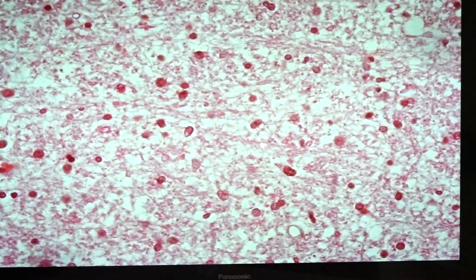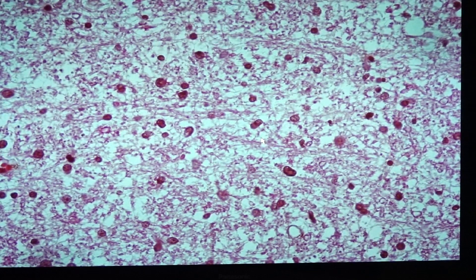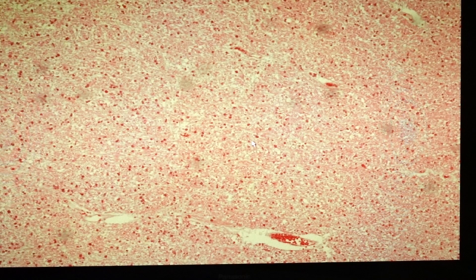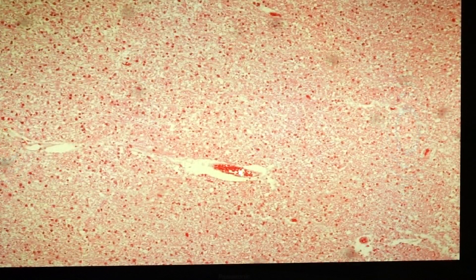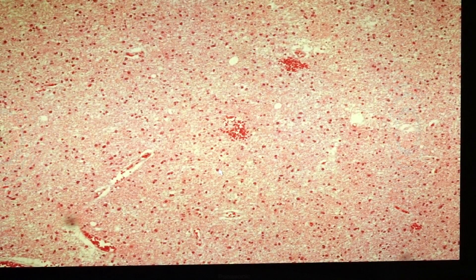To grade it, look at the cellularity and variation in nuclear size. With mild to moderate variation, it's most probably grade one to two. You can see some mitosis and proliferating vascular channels, but not in aggregates, so this is still within normal blood vessel proliferation of the tumor. The aggressive type of astrocytoma is the anaplastic type, falling under grade three, requiring the presence of mitosis or marked pleomorphism.